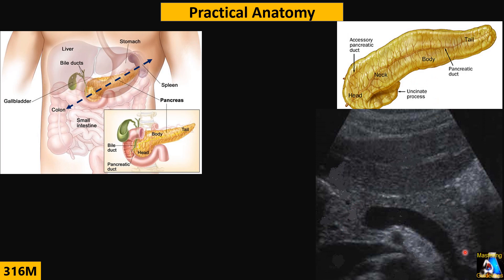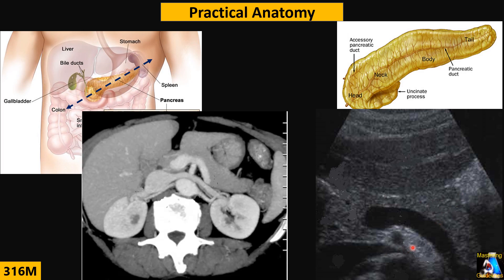You may ask: the pancreas looks straight, so why does it appear as a concave shape in ultrasound? Based on anatomy, the pancreas lies over the aorta and vertebra, so it takes the curved shape of the aorta and vertebra region, and also over the kidneys. That is why we see the long axis of the pancreas as a concave shape.